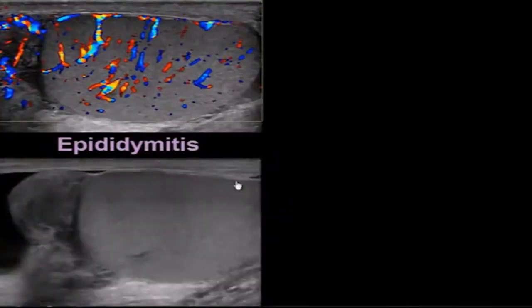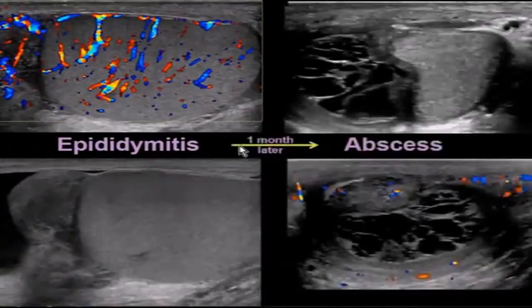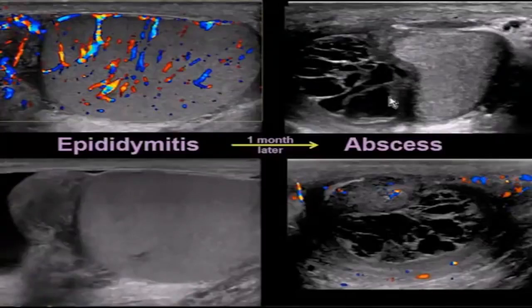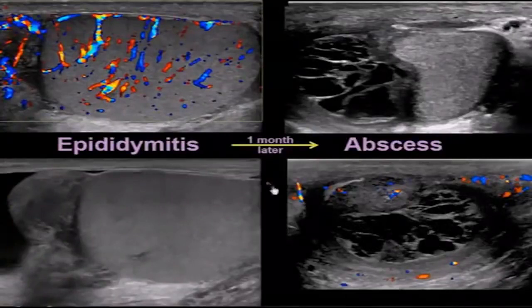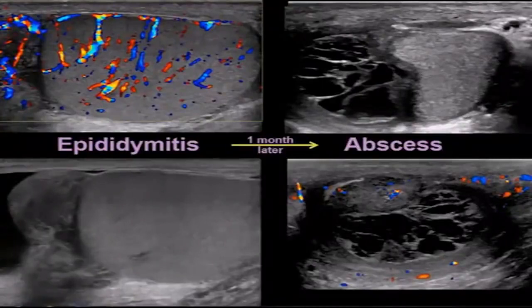This patient went on to develop an abscess — you can see a cystic complex fluid collection sitting adjacent to the testicle. This is an epididymal abscess that developed from the epididymitis. This does not happen too often, but it can happen, and ultrasound is a good way to monitor these patients.